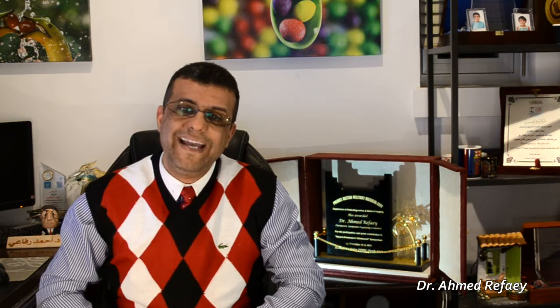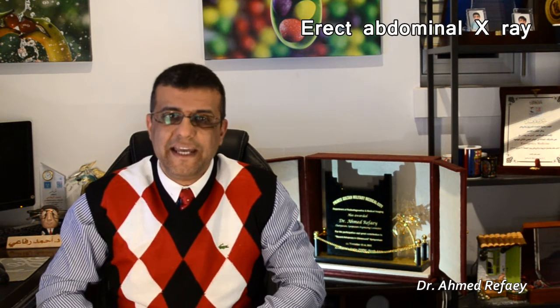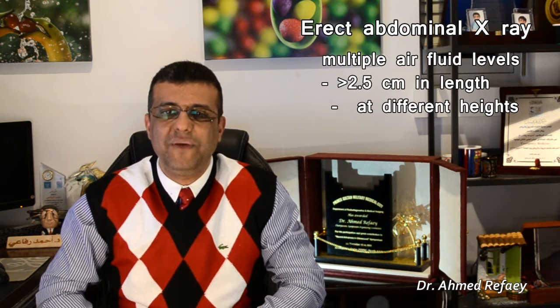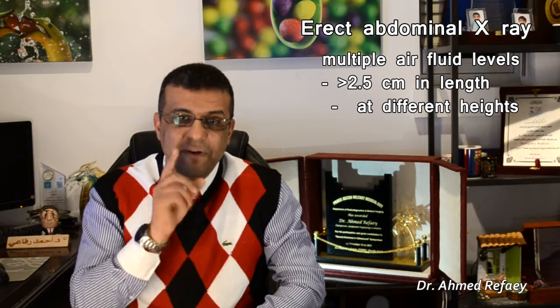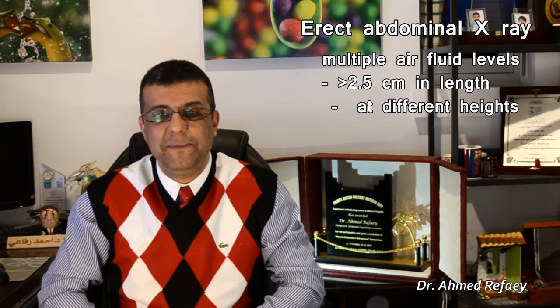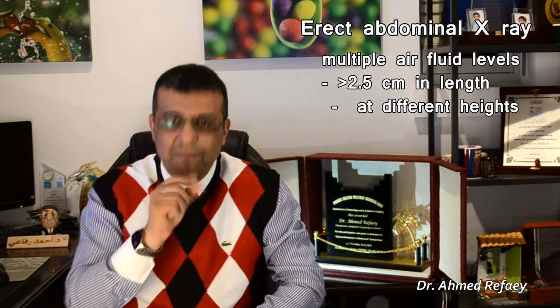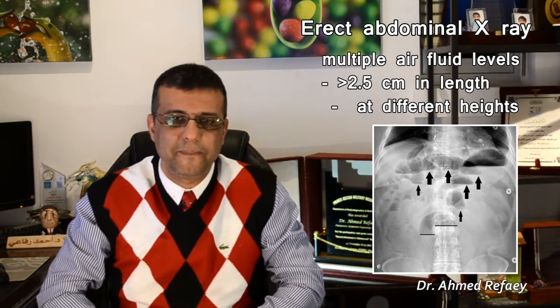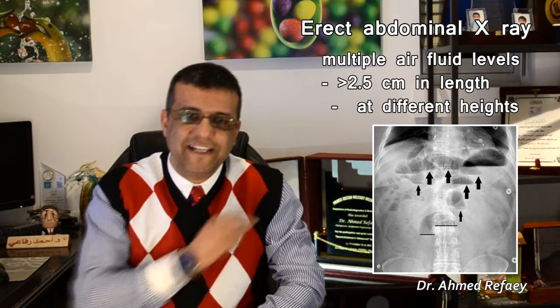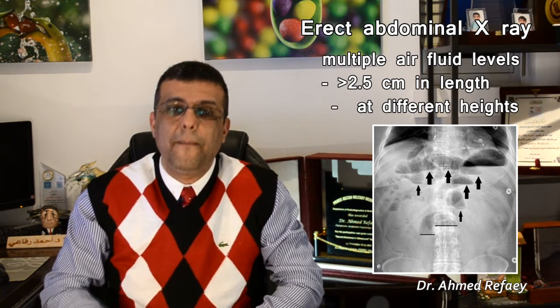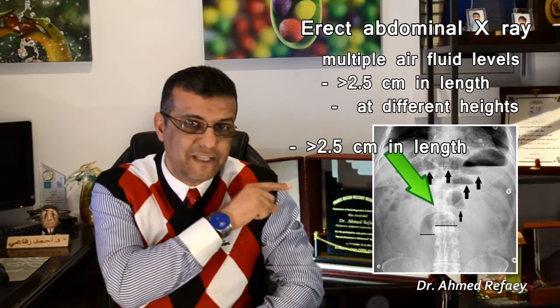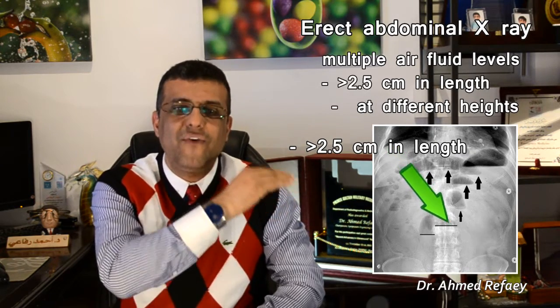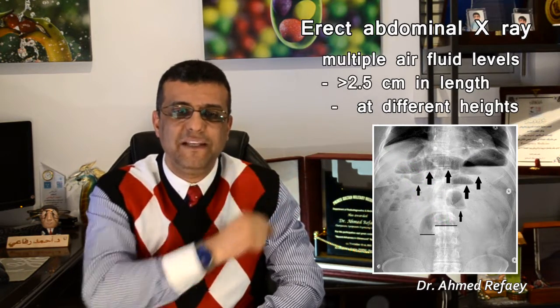What about erect abdominal x-ray? In erect abdominal x-ray, we can appreciate multiple air-fluid levels. The air-fluid level has to be more than 2.5 cm in length, in the same loop of bowel but at different heights, as seen in this image. This erect abdominal radiograph shows multiple air-fluid levels, greater than 2.5 cm, with fluid levels of unequal heights in the same dilated loop of small bowel.